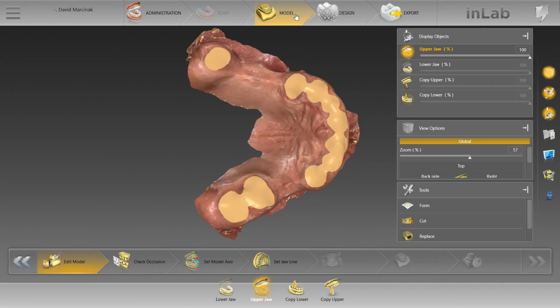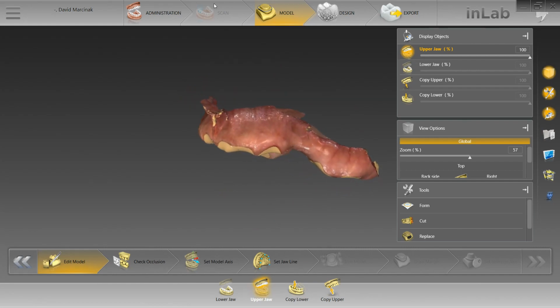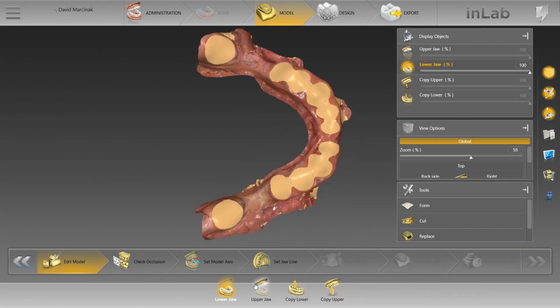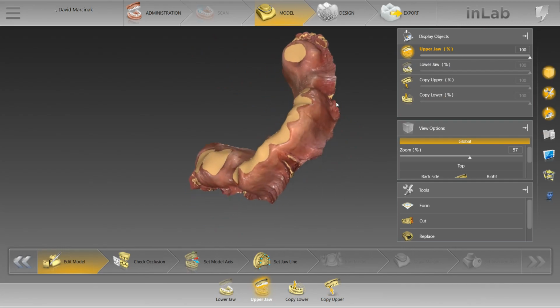Now, this case was sent to me through Sirona Connect. The dentist sent the scans. Nothing was scanned on my end. So I just took the scans. And one thing that I do require from the dentist or the CEREC user to create a digital wax-up is 2 scans in each jaw. So we've got the upper jaw, but you could see this is virtually prepped. So you're going to want a second scan.